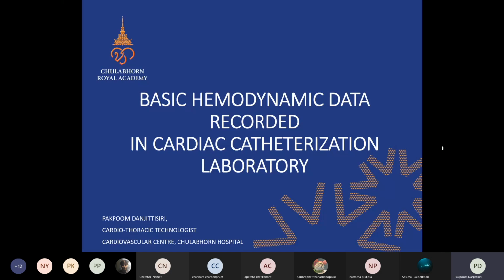Today I'm gonna talk about basic hemodynamic data recorded in the cardiac catheterization laboratory.